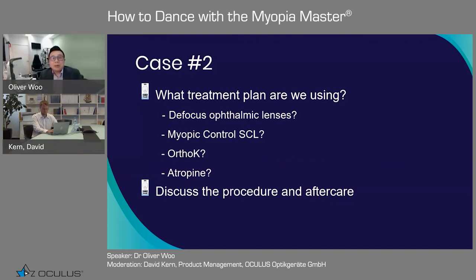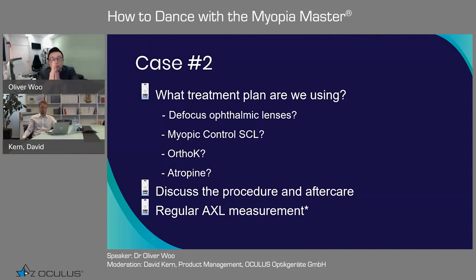It shows them that we care about the kids. We want them to see us regularly. We want to take care of them. We want to know what is happening with the eyes. An important part, we want to stress to them, we want to see the size of your eyeball. I mean, your kid's eyeball size changes. This is something really important, the size change. Because with the parents, we will help them to shift from the diopters to the actual length, the millimeters. Something we have to help them to understand, we care about their ocular health and also the prescription. That's something we try to help with, together with the parents. We align together to know what we're doing and how we're doing things in the same direction.